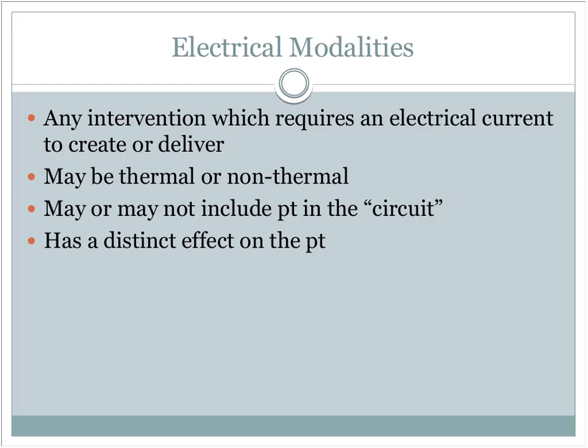Ultrasound does not use the patient as part of the circuit. The electricity goes from the machine into the sound head, stimulates a crystal. Electricity then passes back through that sound head, back into the machine, and the patient only receives the vibration through ultrasound waves that occur out of the sound head, but none of the electrical current. So if you ever have a patient who says, oh, I feel stinging or tingling or electricity coming from that, discontinue use of the machine and have it serviced because it may not be grounded correctly.